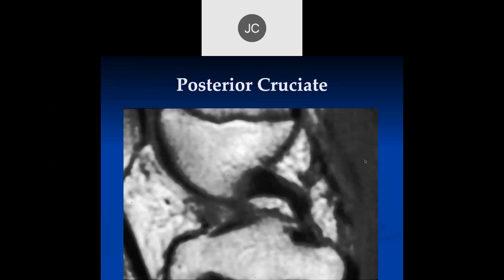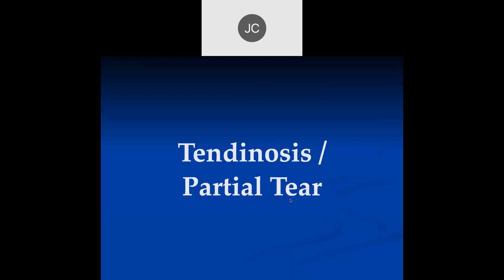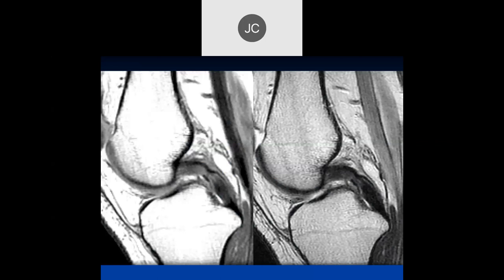Let's go on to the posterior cruciate ligament. We can look at tendinosis and partial tearing. Looking at the PCL, it looks like it's intact with increased signal, so we've got some tendinosis.